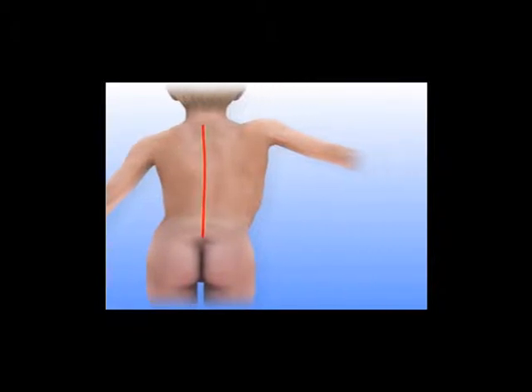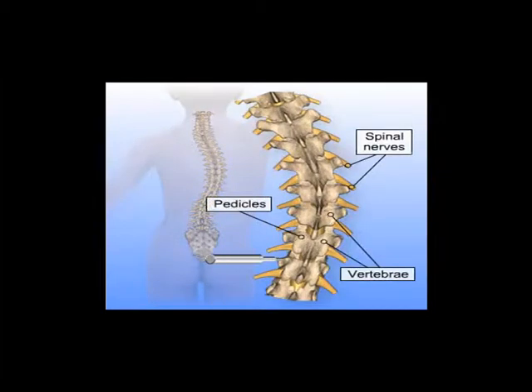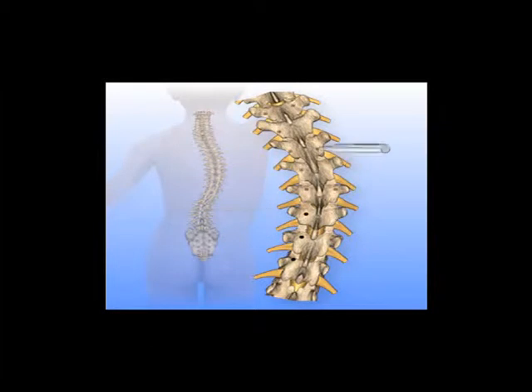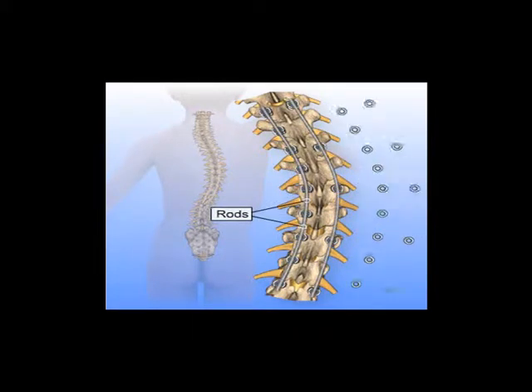A long incision is made in the middle of the back. Once the spine is exposed, surgical instruments are used to prepare for the instrumentation. Holes are made in the pedicle of multiple vertebrae on both sides of the spine. Screws are placed in the drilled holes, and metal rods are positioned between the screws and fastened in place.